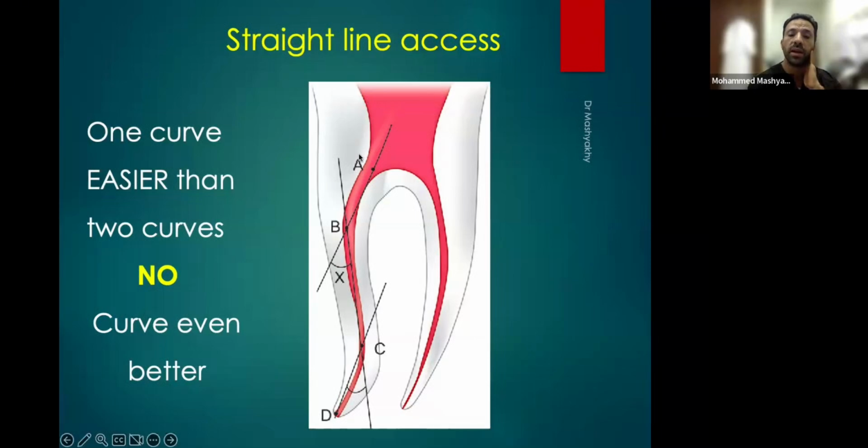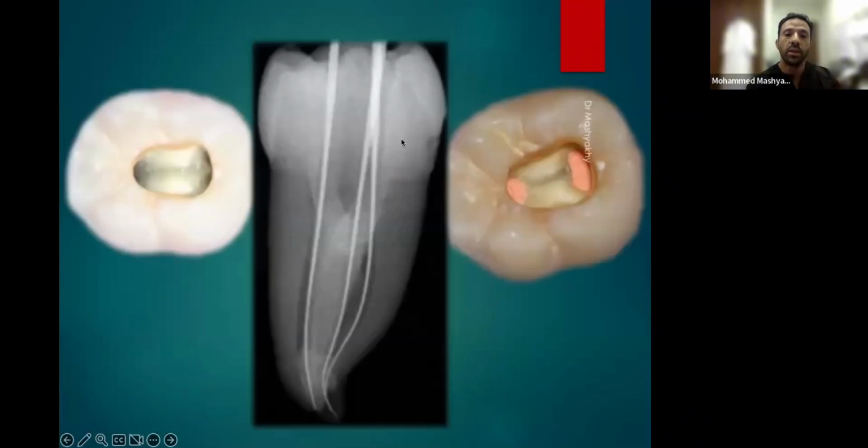So it's always better, if you go around it, to try to remove it with a tapered diamond bur, Endo-Z, ultrasonic, whatever you have. You can just start and remove it in there, okay? Until we can get this shape. After you get this shape all the way down, that means you are getting your working length. That means you already get an X-ray. So now we start to have your rotary files working.